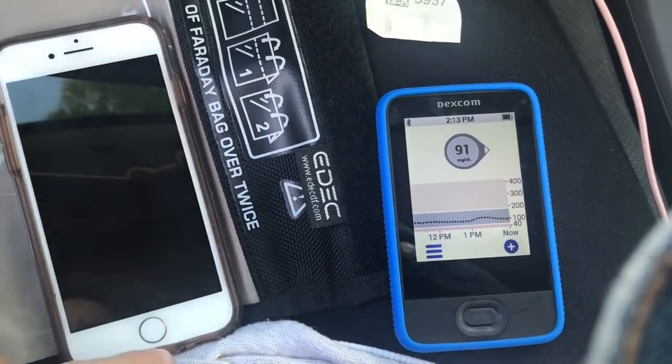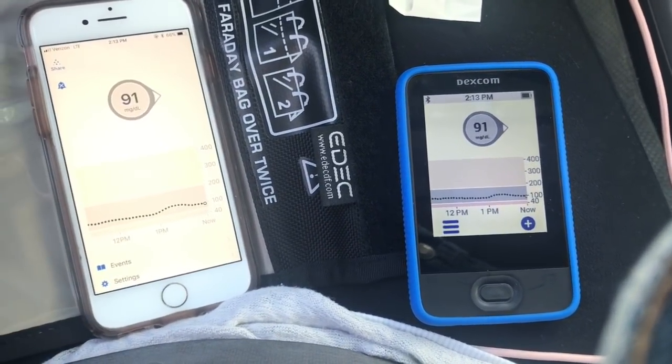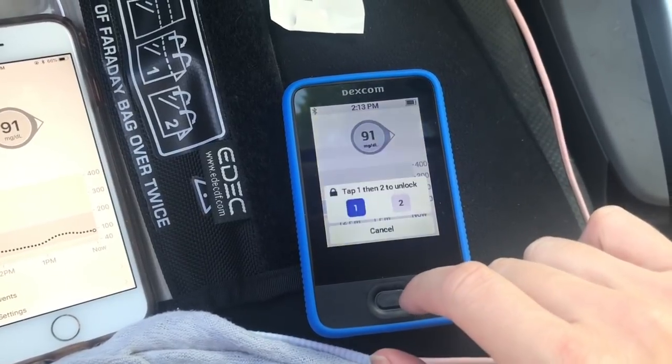We just got a fresh blood glucose on the receiver, so we have five minutes in which to start the restart process.